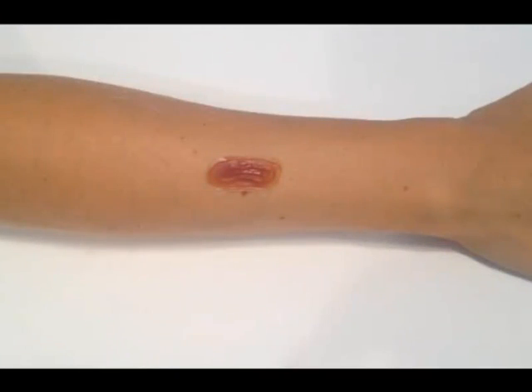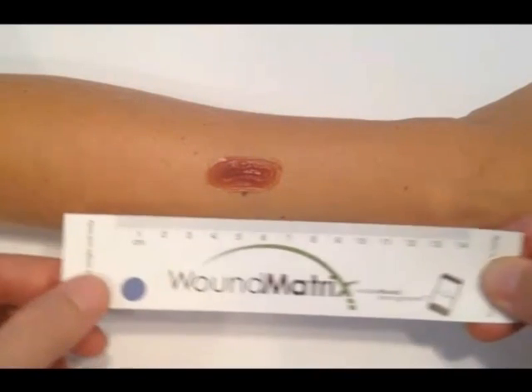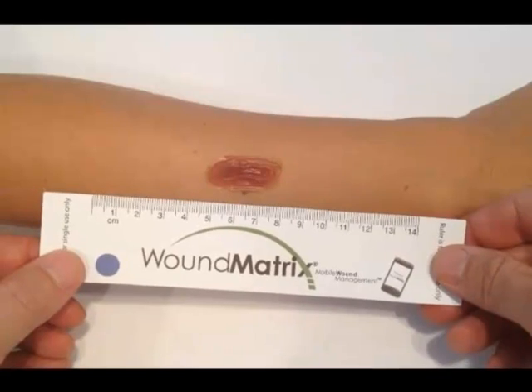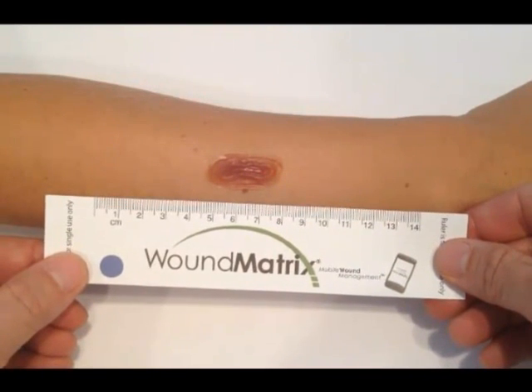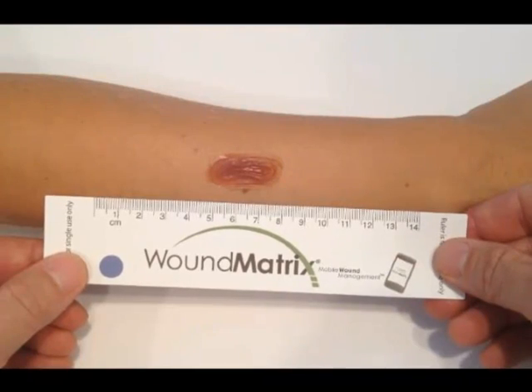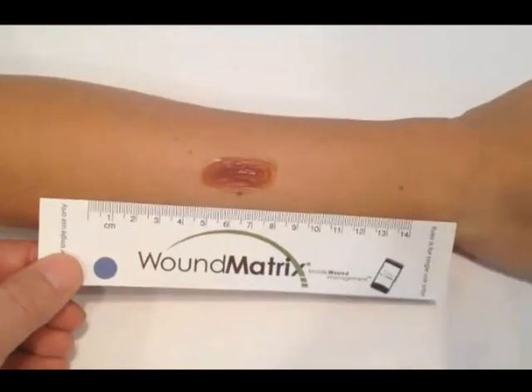To prepare to take your photo, on your own or with assistance, place the ruler next to the wound area to be photographed. Make sure to use only the NIST certified ruler included with your kit. Make sure the ruler is flat and on the same plane or surface as the wound. Do not angle or tilt the ruler.